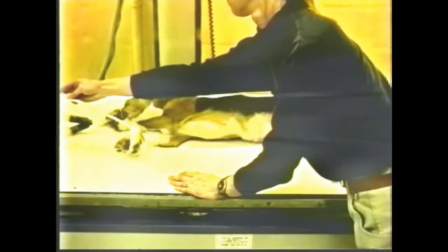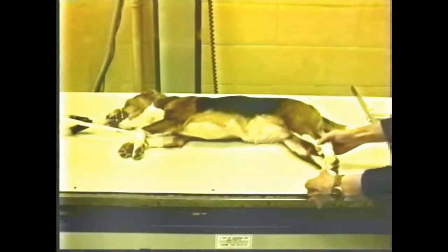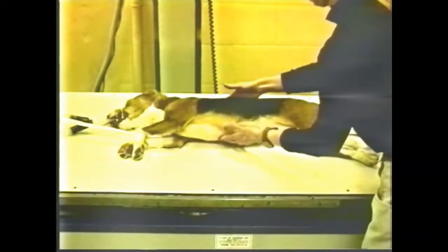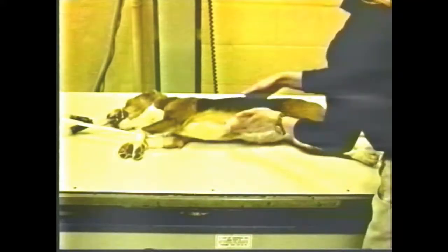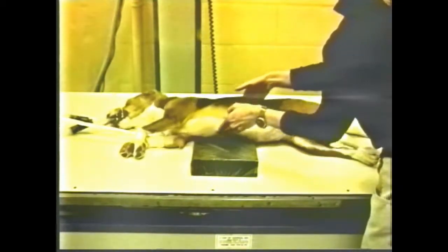The animal would be placed in lateral recumbency to do a thoracolumbar spine. Tape is placed on the fore and hind legs so that the legs can be pulled forward and backward and apply tension to the spine. This tension helps reduce the sag in the lumbar spine area. The animal is palpated so that it is horizontal. A sponge can be placed under the sternum so that the sternum is lifted, assisting in this proper positioning of the spine.